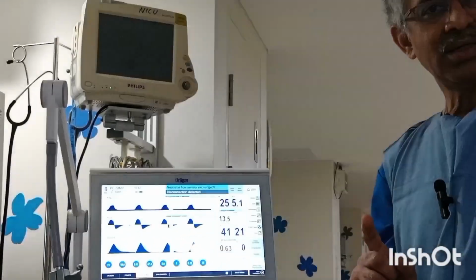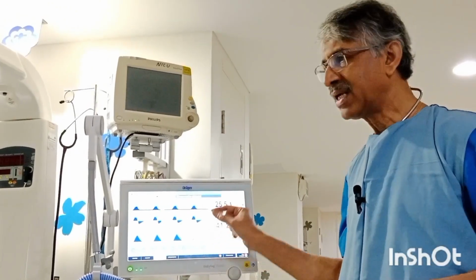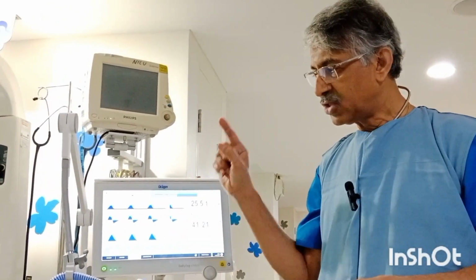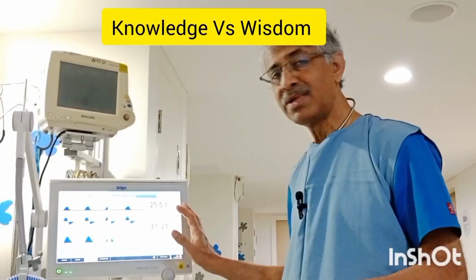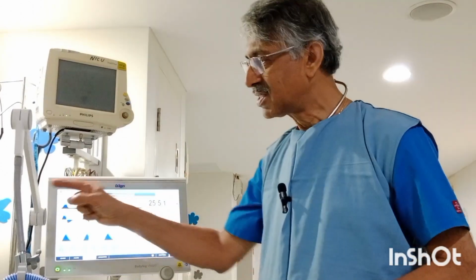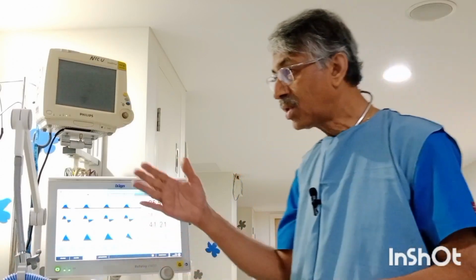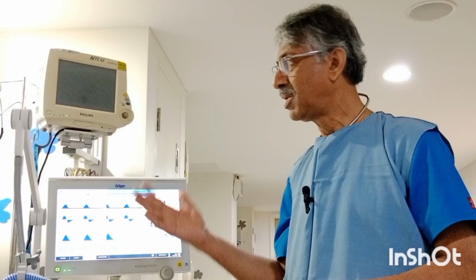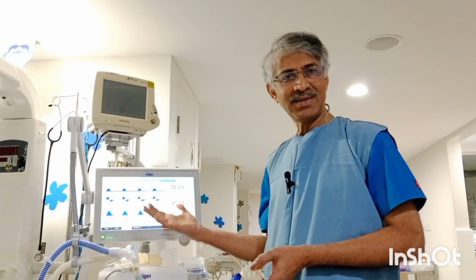But what is important you should understand: when you see pulmonary graphics, don't rely on graphics alone. You need to have knowledge and wisdom. Having knowledge of pulmonary graphics is important. What is the wisdom? Relating the pulmonary graphics to the clinical condition of the baby. When you see an abnormality, look at the baby. If the baby is otherwise comfortable and doing very well, you need to think whether you need to give importance to this. If you keep on looking at these graphics, you may get a lot of information.